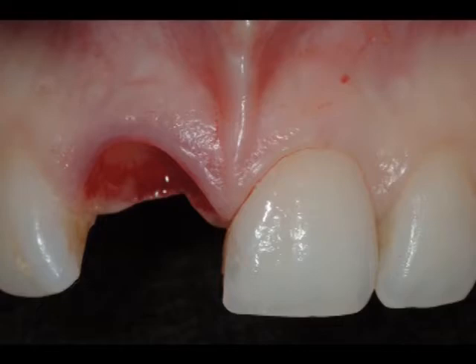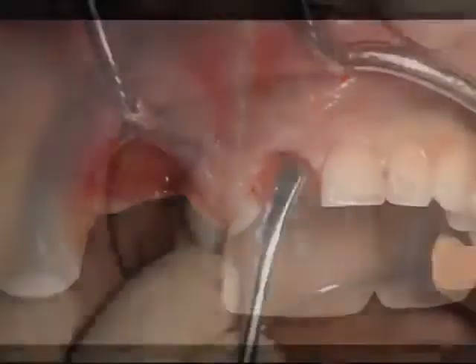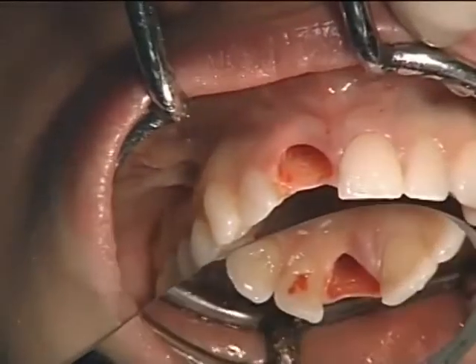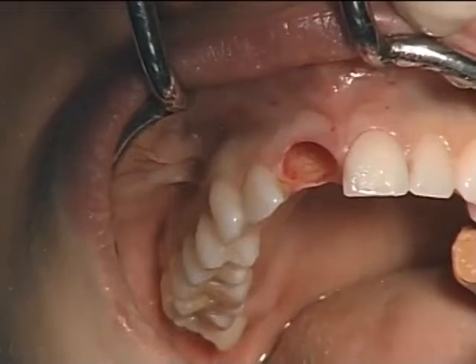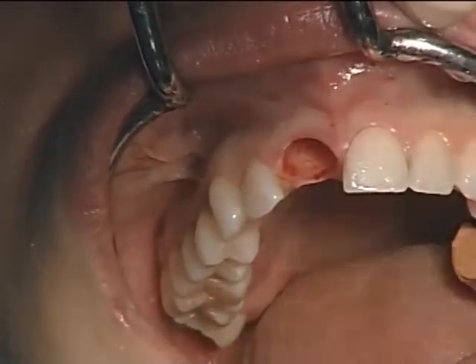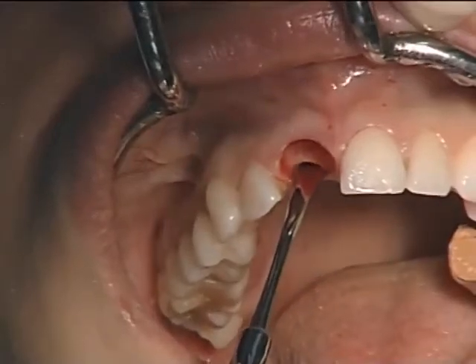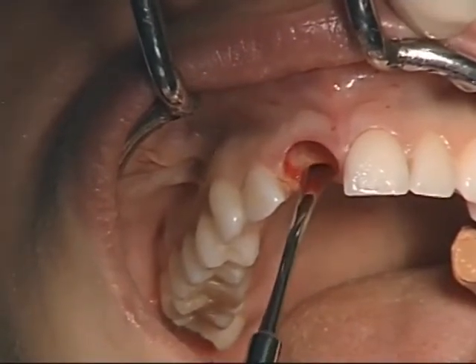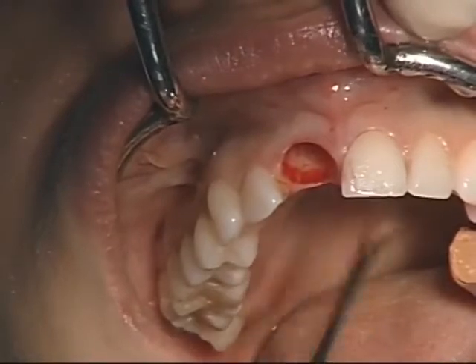After our manual curettage and rotary instrument debridement of the area, we place a temp stent into the site so that we can start to formulate our ideas and opinions about where our implant should be placed: angulation and depth of implant placement. And this is our guide, which will also be our temporary that we will use when we retrofit back to our abutment.